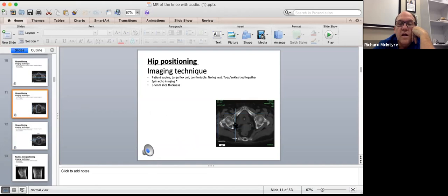With this one, most radiologists prefer we don't angle along the neck of the femur, because we're actually looking at the joint and the head of femur and all the muscles around it. They like to go perpendicular or orthogonal to the patient. So that's sagittal and that's coronal, from the front to the back of that hip.